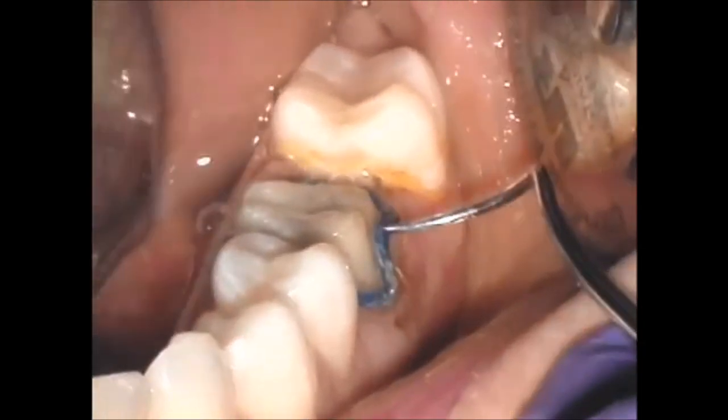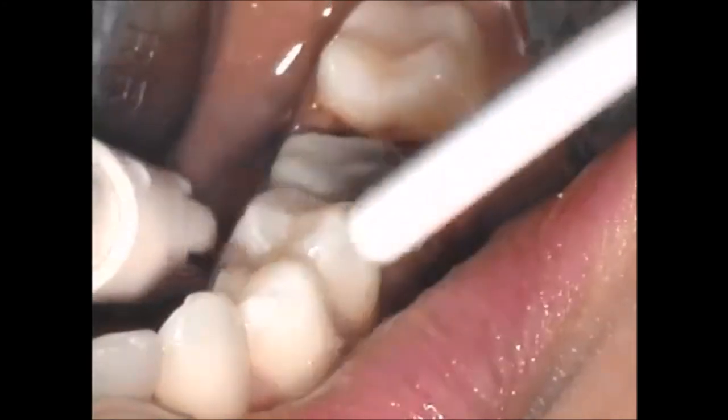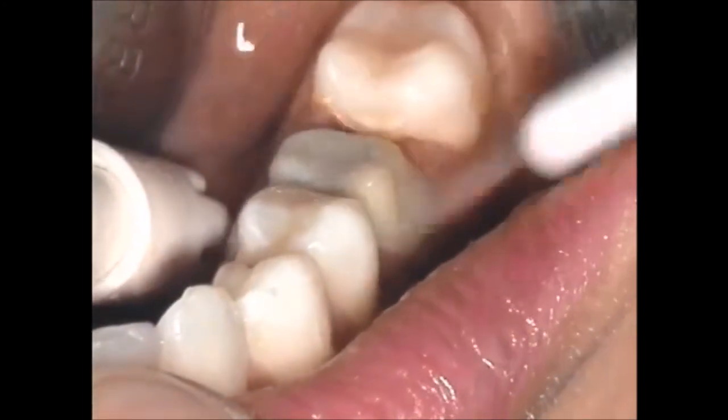Remove the cord and once again, clean the area and test for completeness of hemostasis with a firm air-water spray before the impression material is mixed.